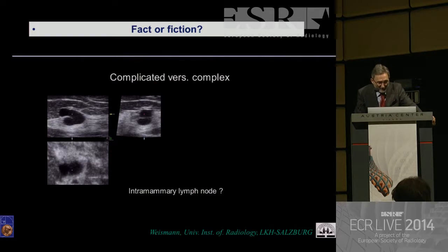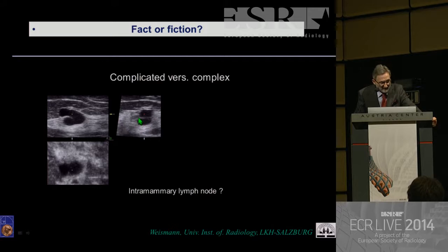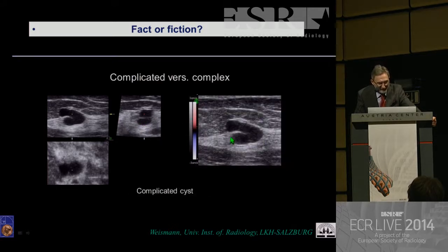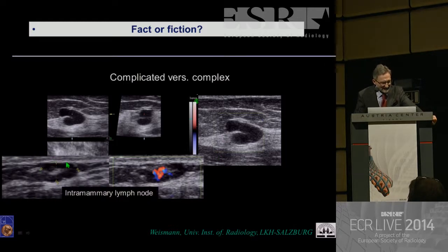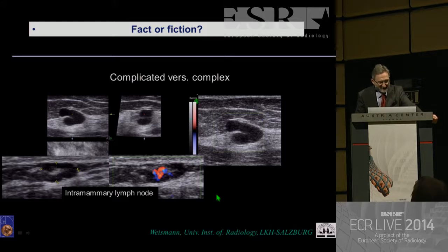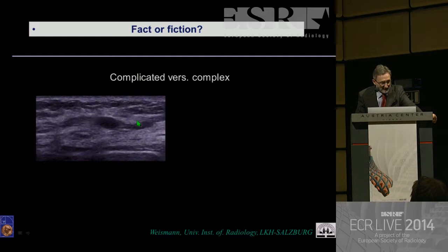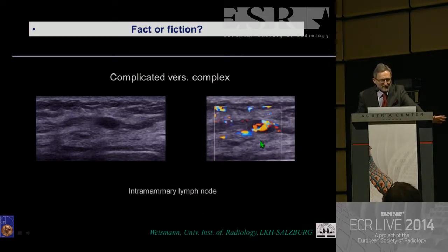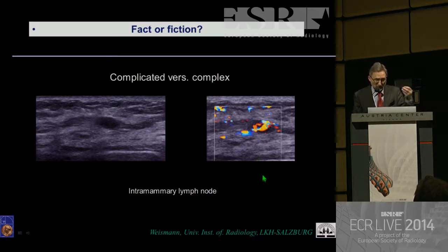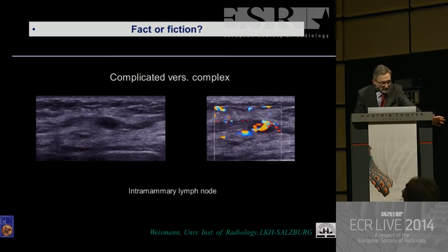Complicated cyst versus complex cyst: is this an intramammary lymph node or a cyst with a thin septum? Go for color Doppler — there is no vascularization. An intramammary lymph node shows vascularization with hilar vessels. You can visualize vascularization of hilar vessels even in very small lymph nodes. So lymph nodes can be very echo-poor and the discussion may arise whether this is a complicated or complex cyst.